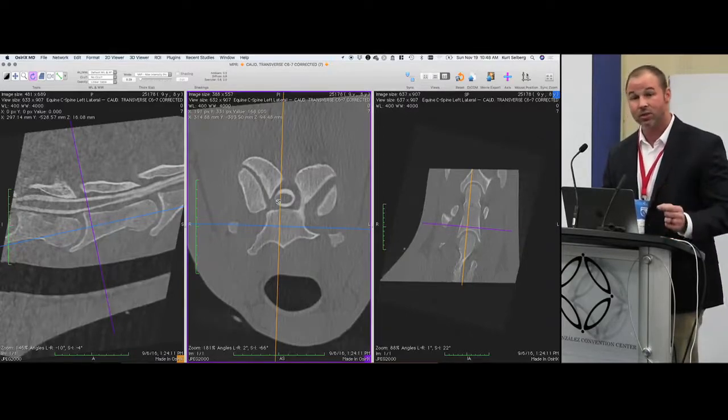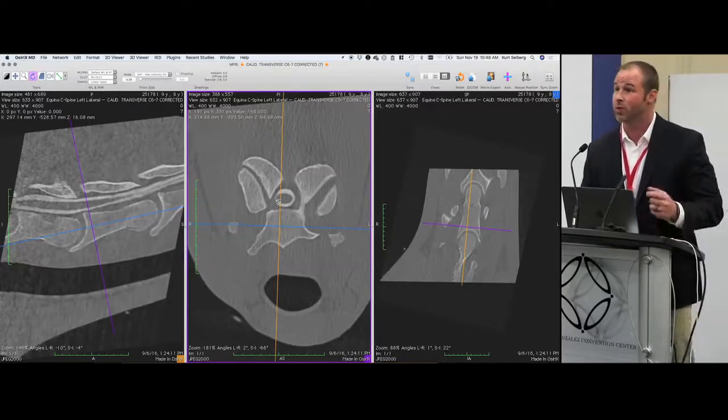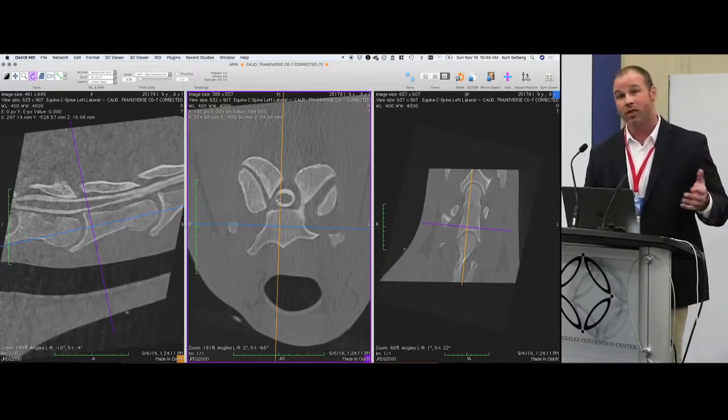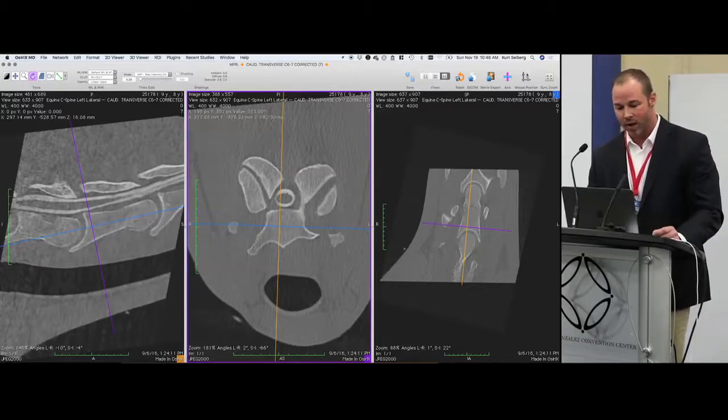And so this is a huge advantage in looking for areas, and there are a lot of times that myelograms are equivocal in their findings. So one side versus another side, and we're not necessarily going to see that particular area on our standard myelograms, and we're going to have to look at our CT myelograms. We're understanding more and more about what is happening in our pathologic change with our caudal cervical spine specifically, with our CT technology.